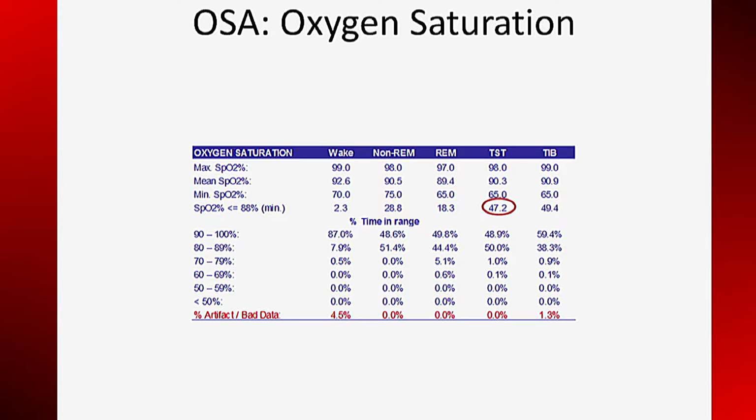There are 47 minutes of significant hypoxemia. Although this patient qualifies for nocturnal oxygen therapy, oxygen should not be prescribed until after CPAP is tested. It is quite possible that CPAP will eliminate the need for oxygen.